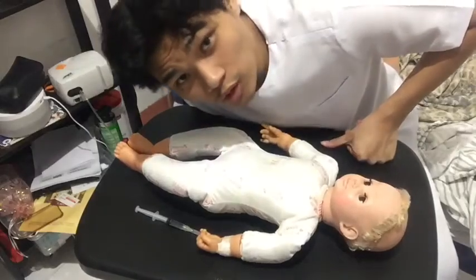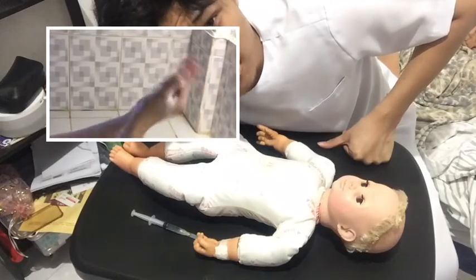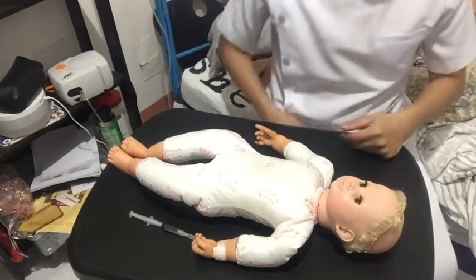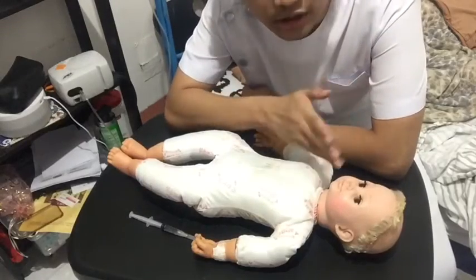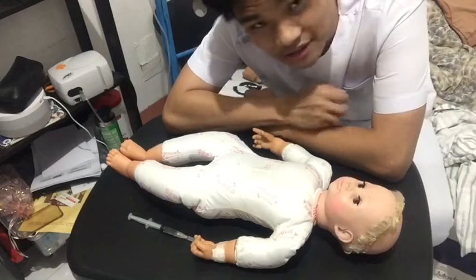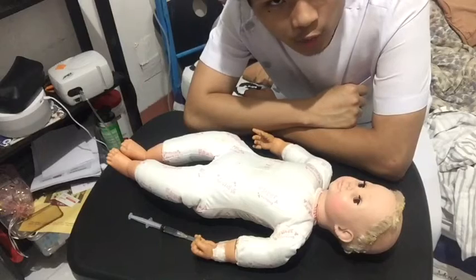Now, when we're going to start the performance phase, the first thing that we're going to do is the proper hand hygiene technique. After washing your hands properly, the next thing that we are going to be doing is explaining to the mother what we are going to be doing, especially the nebulization. We can also explain to the mother the possible side effects. The purpose of this is to avoid anxiety, and most especially to give them more knowledge on what we are going to be doing.